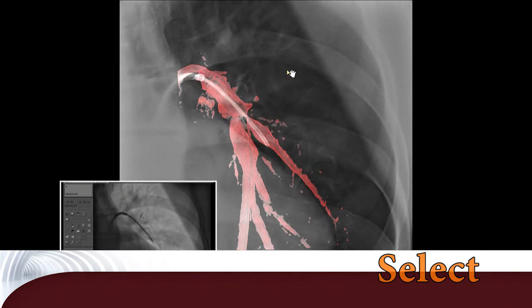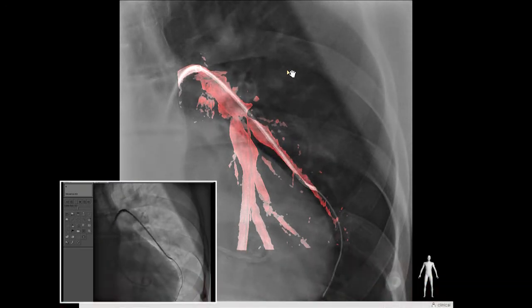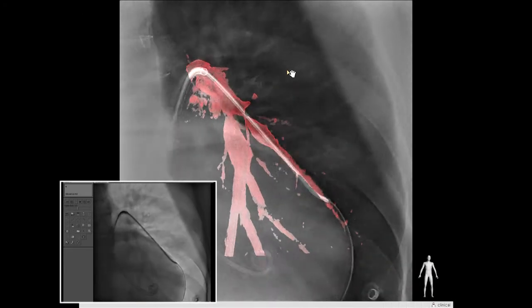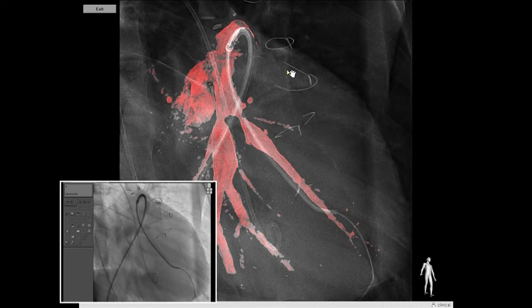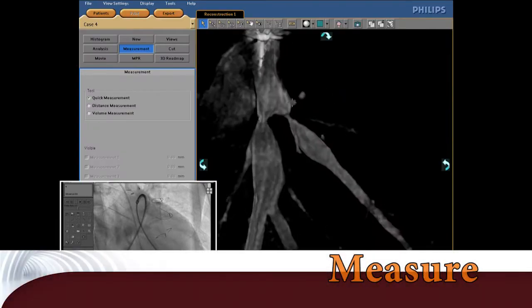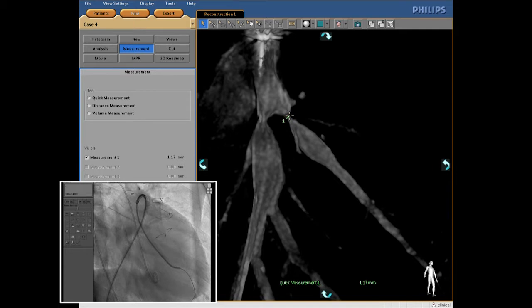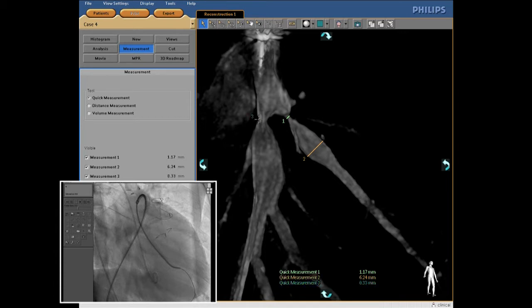We are now measuring the diameter. Because the angle is very accurate, we change the catheter with the right Judkins catheter and can select this branch. The minimum diameter is 1.2mm going up to 6.2mm. We can see the selected vessel and rotate to confirm it's the same vessel while rotating. This is the most stenotic vessel.